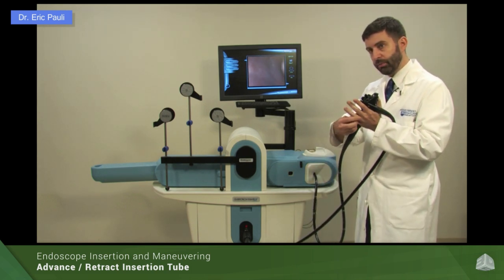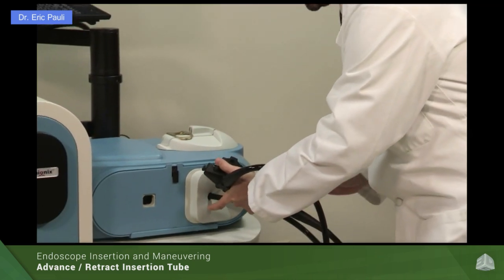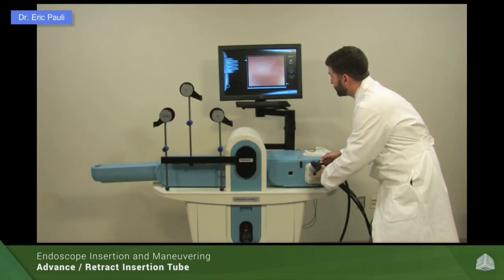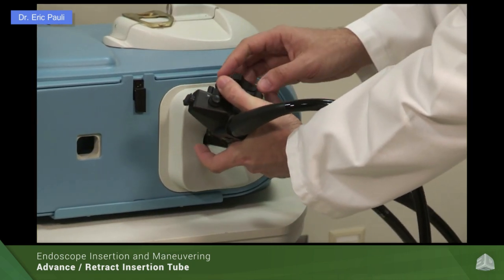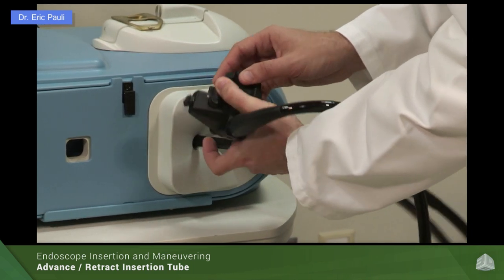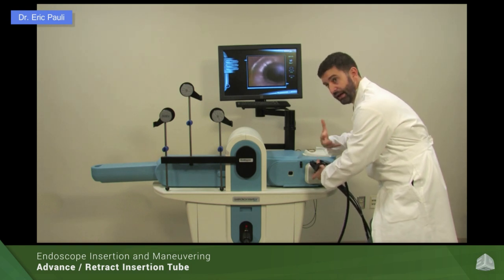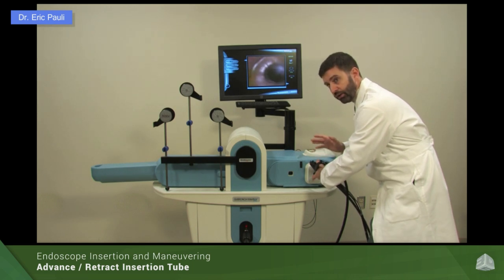Here's how we do the three-handed technique: use your pinky and ring finger on the left hand to loop the scope into your hand, holding the scope in position. You can then use your right hand to work the little wheel and your thumb to work the big wheel, while with this hand you can provide a measure of in-and-out motion and a little bit of torque while at the same time having your hands on the control knob. You can see that to do this I'm a bit hunched over, which is uncomfortable — so you wouldn't want to be here for very long — but for very difficult scope maneuvers, this is a great way to work three-handed.